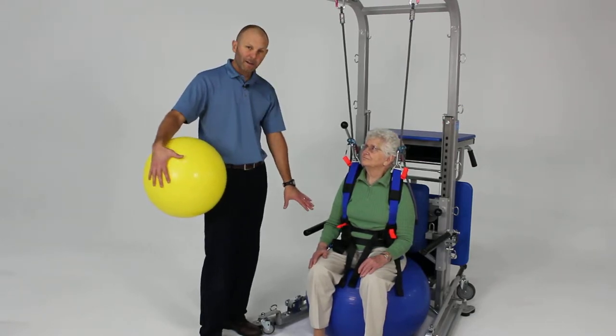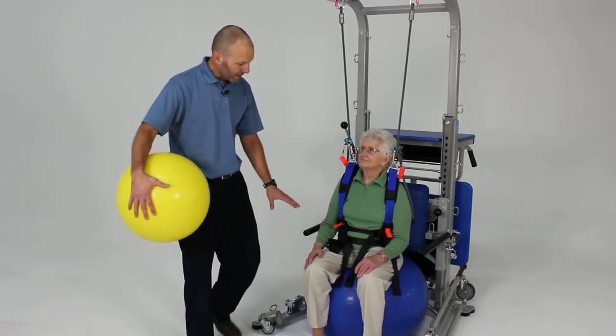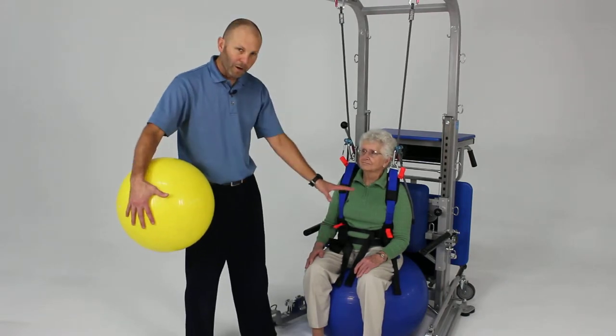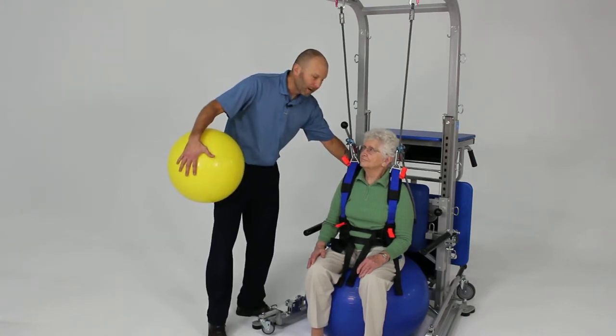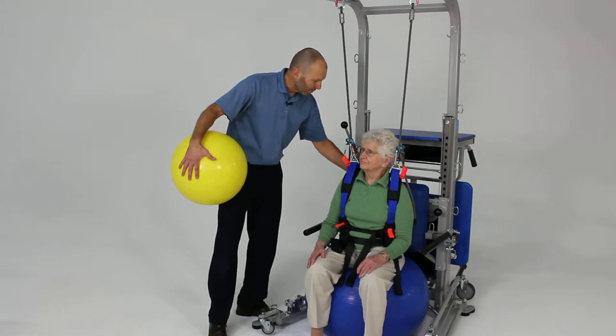Here we have her seated on a therapy ball. The nice part about the rehab station is that the base provides some limitations on how far the ball will move — it allows some movement, but then blocks that movement. She's also got some support from the pad back here that's giving her a little bit of proprioceptive feedback.